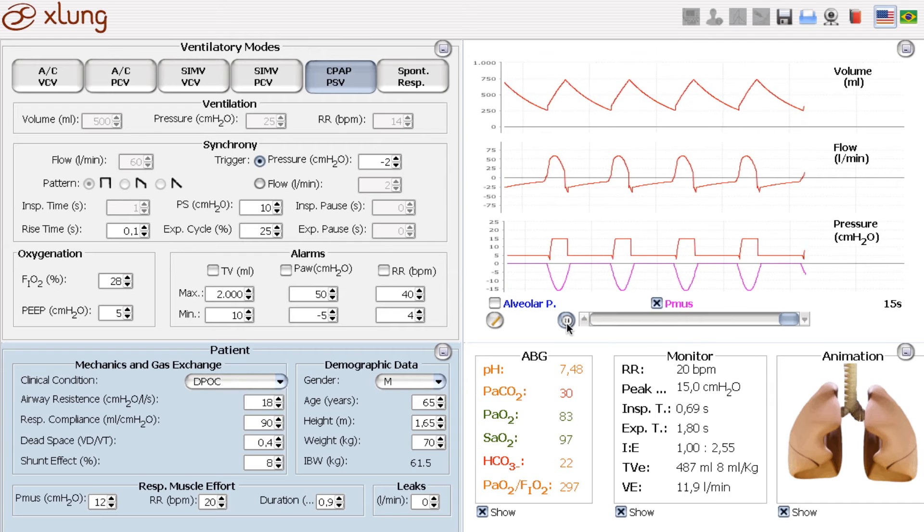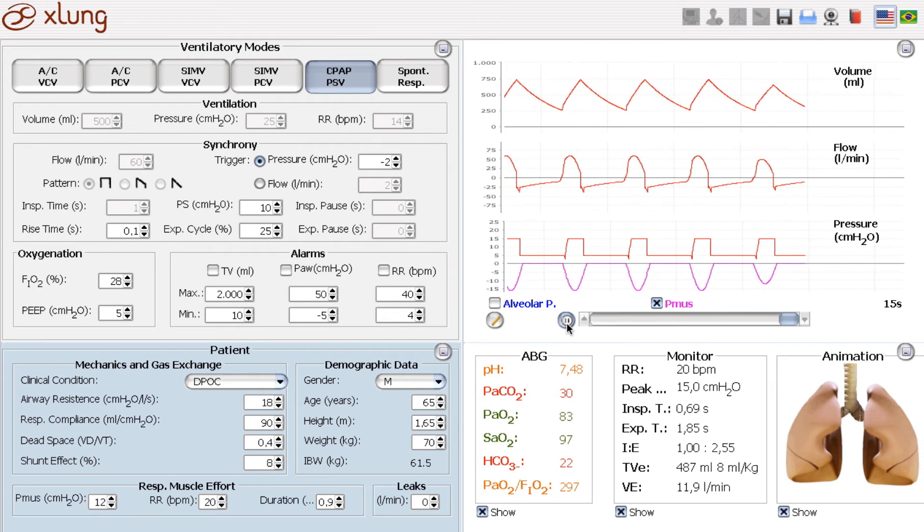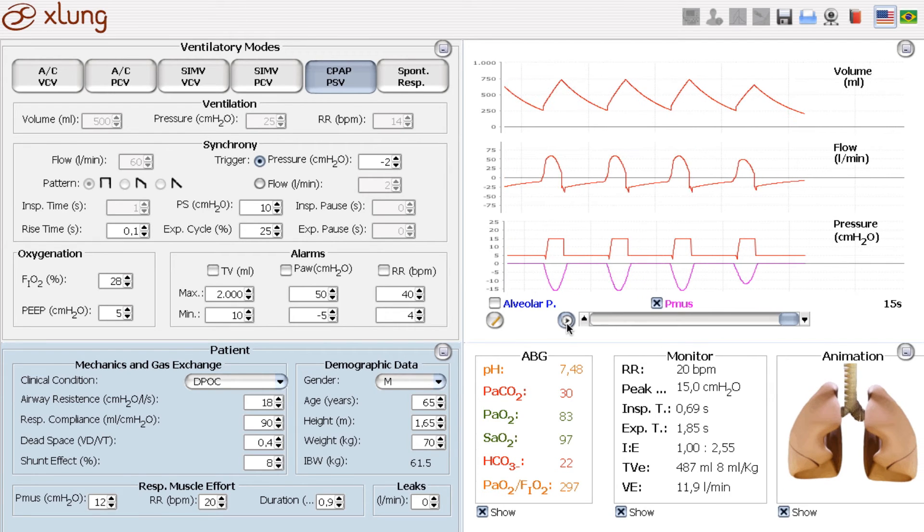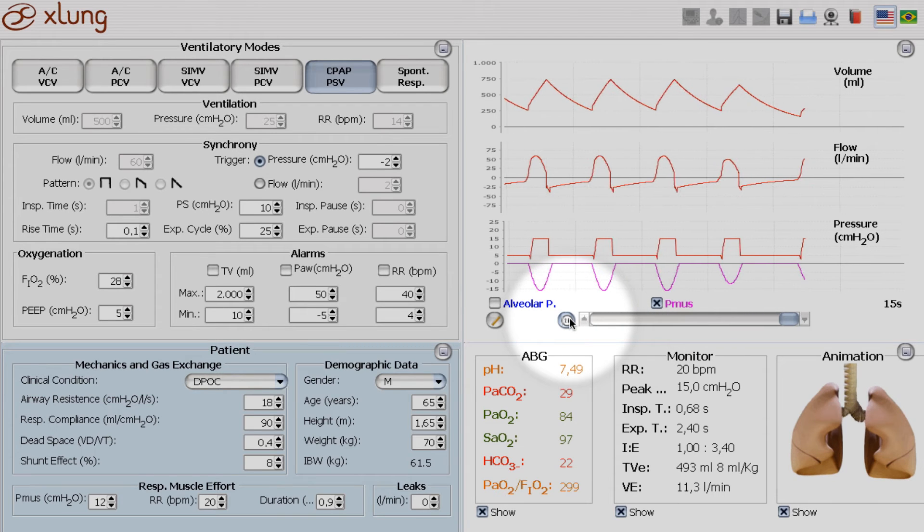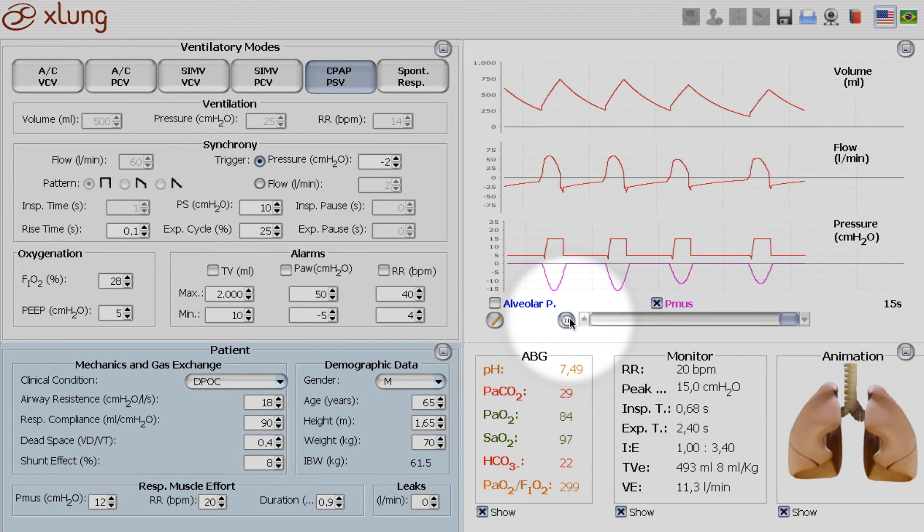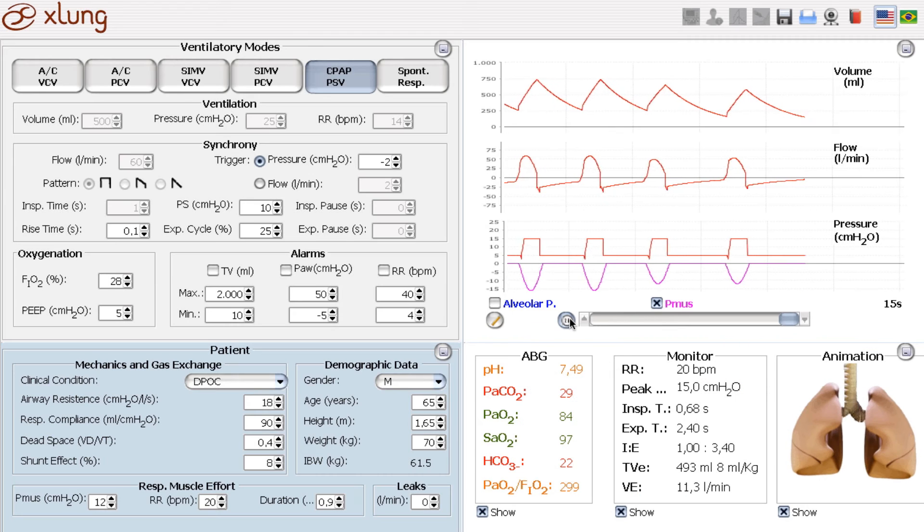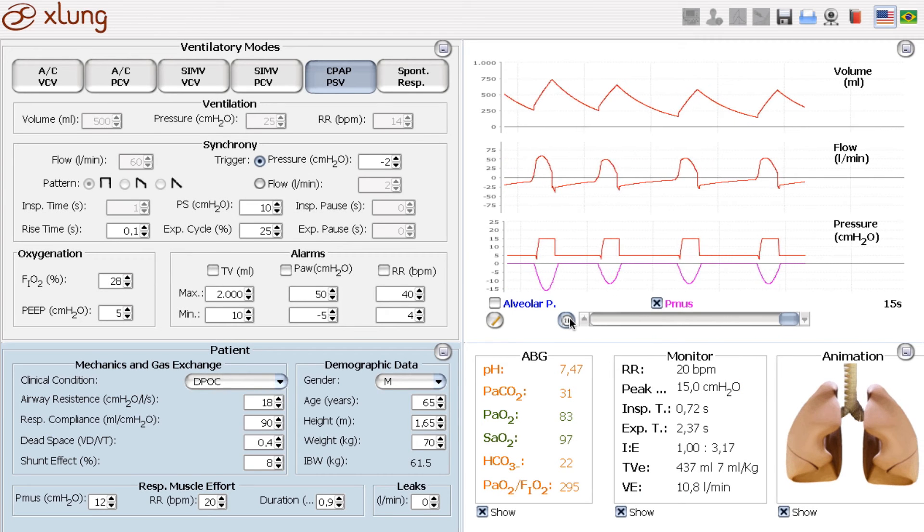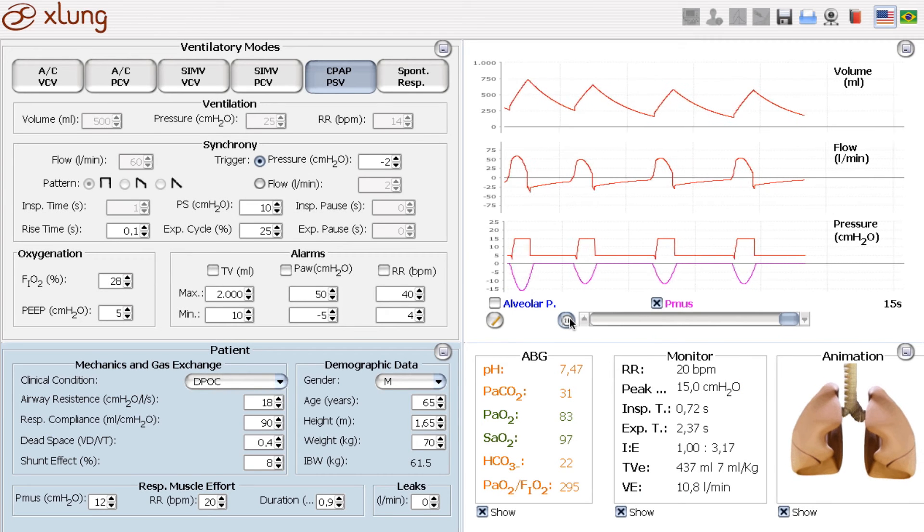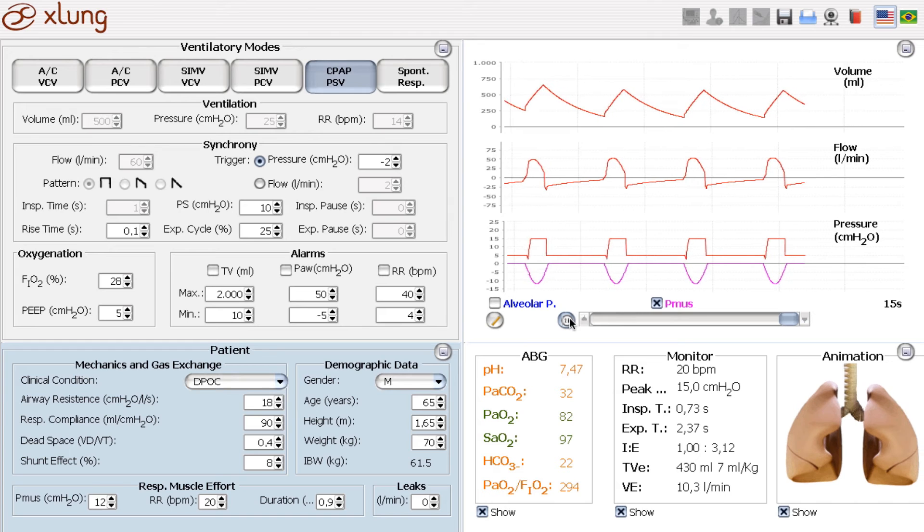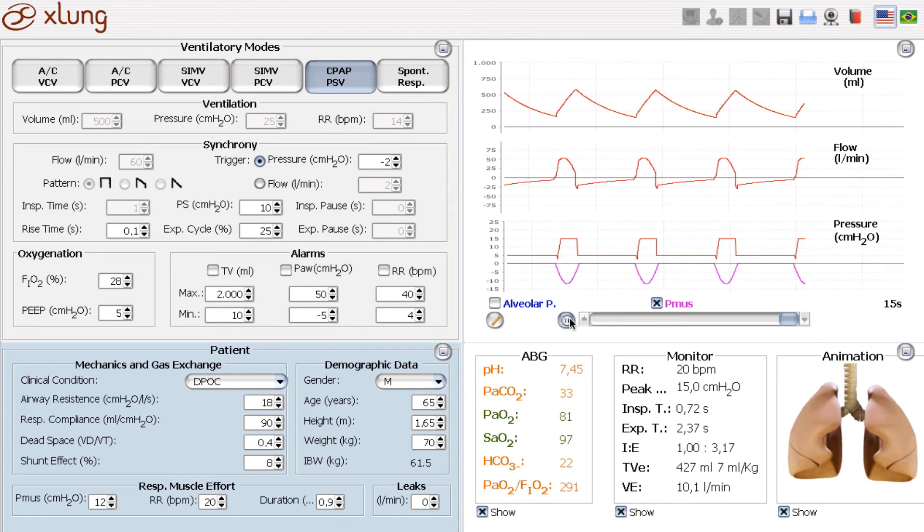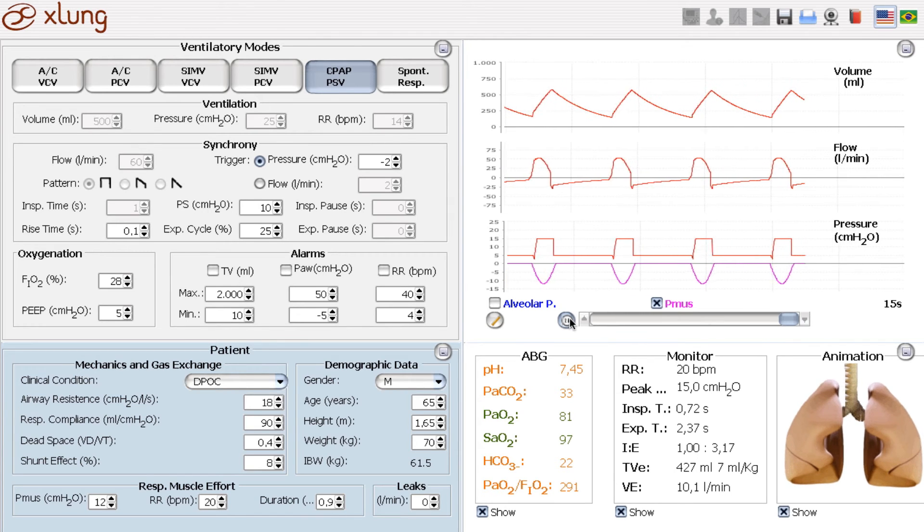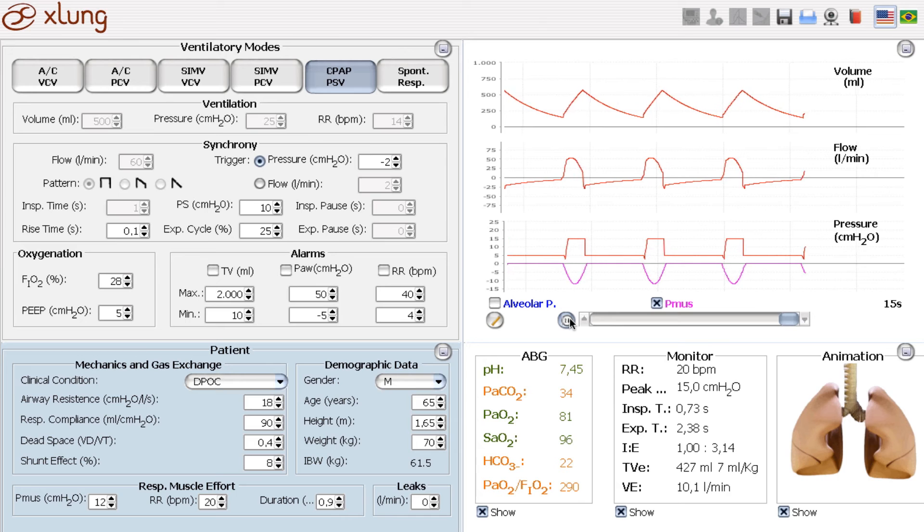And we see here, look at the curves. The PMUS is now reduced. And the patient can still have a good tidal volume to maintain his minute ventilation and to maintain approximately normal pH and PCO2.